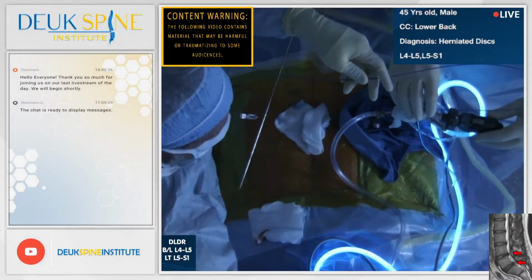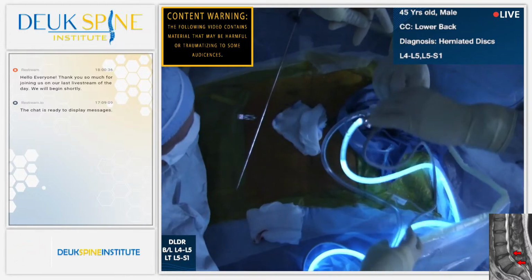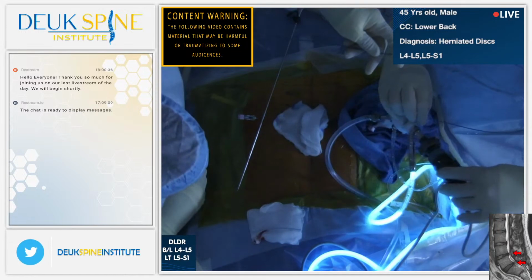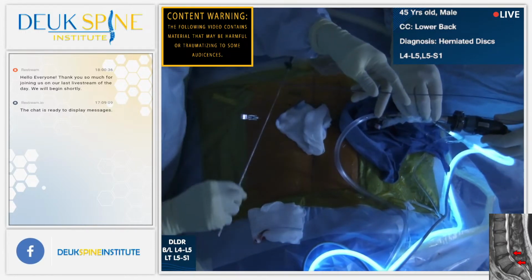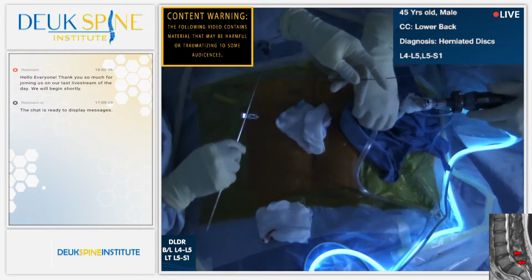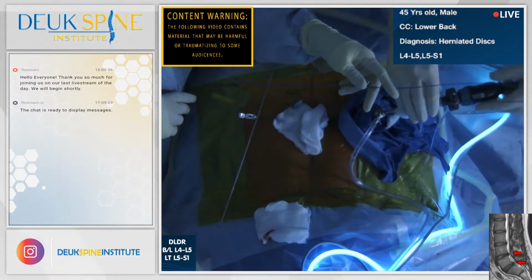All right, any questions from our audience? No questions? Pretty cool, huh, Sanjay? You see how the needle gets melted with the laser? Yes, I do. Okay, there we go.